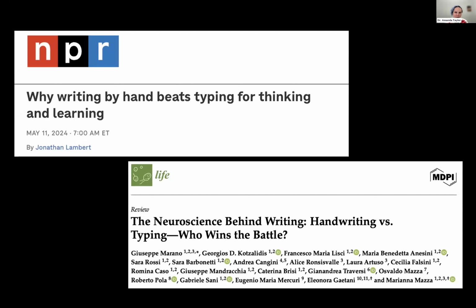So moving forward in this lecture, I hope you got a pad and a pen or pencil so that you can write down some tips. But also, as you move forward with your neurointerpretation of MRI, consider writing down your findings when you begin to formulate them moving forward.